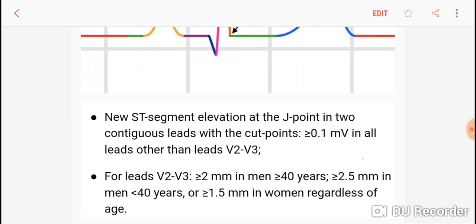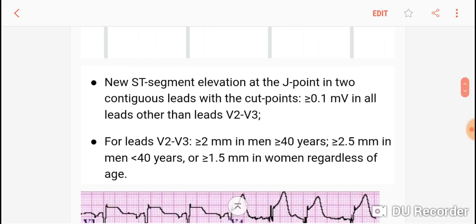V1, V2, V3, V4 are the anterior leads. V5, V6, and AVL are the lateral leads. Leads 2, 3, and AVF are the inferior leads. So except for V2 and V3, one small box elevation at the J point that is new is a STEMI.